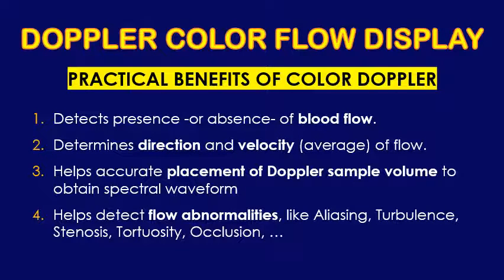So as we know, since color Doppler doesn't show me the accurate velocity, what is the practical or clinical benefit of color Doppler? It detects the presence or absence of blood flow. If you put color and you see there is coloration of a vessel, you tell that there is flow in this vessel. If there is no color, this is one of the indications that we might have no flow here, besides other possibilities.